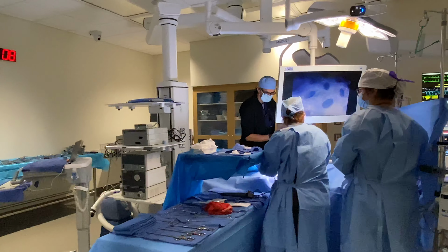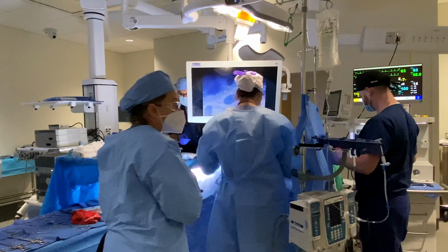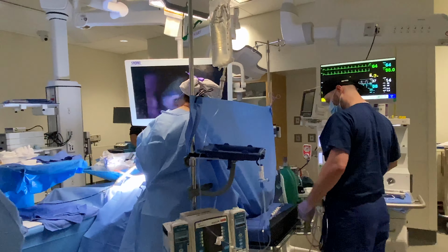Another goal of Vapor Camp is to teach the residents how to engage with the surgeons, know when to call for help, and to immerse them in environments and clinical situations that they'd encounter their first several months going into residency.